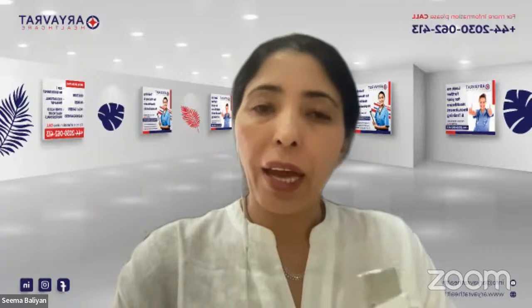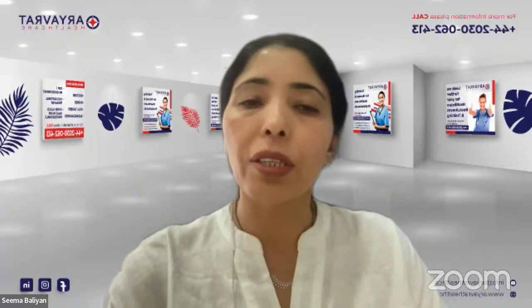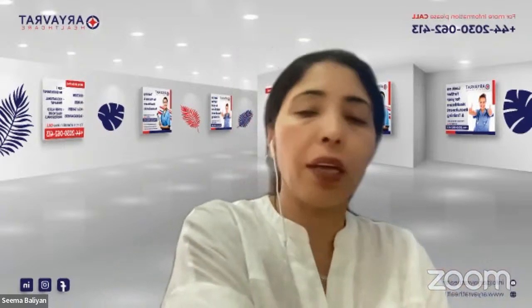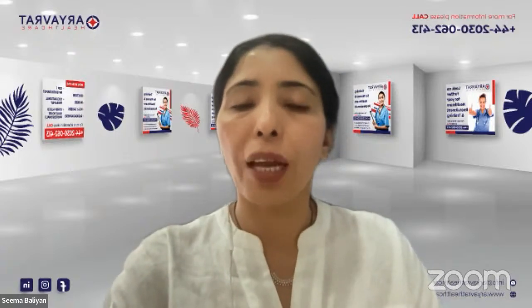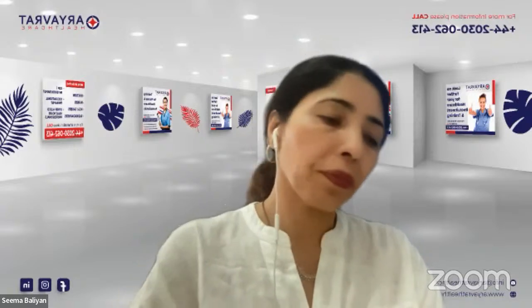Once you have done the 5 breaths for the second time, you are going to tell the patient, okay, I have given you the medication as per my drug chart. So you have taken 2 puffs of salbutamol inhaler, and you are going to be signing the chart.